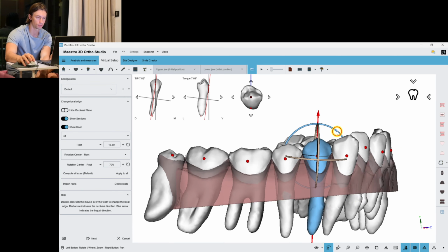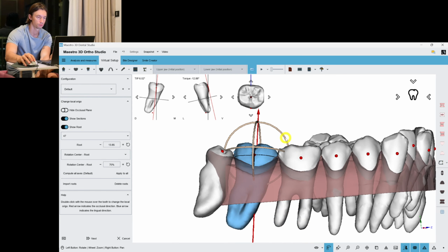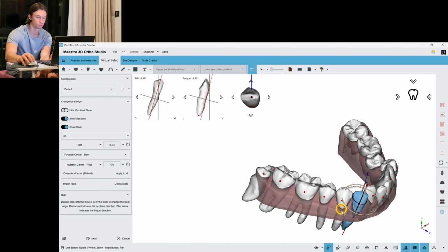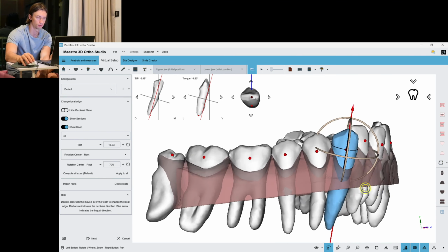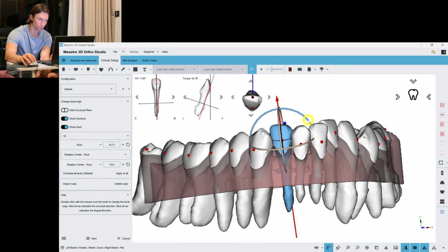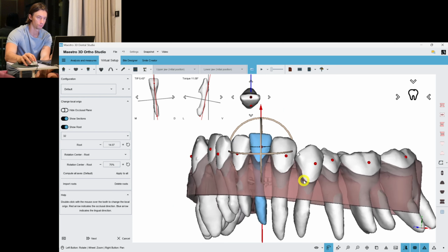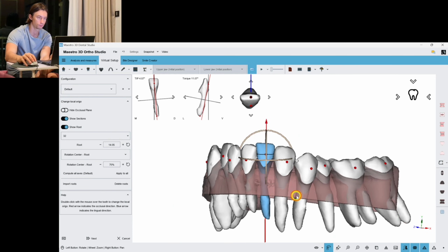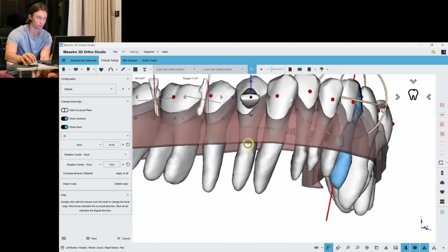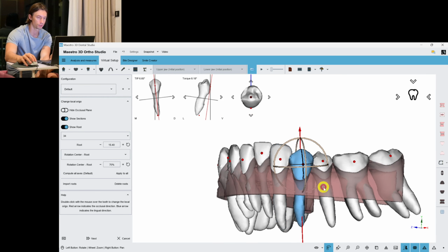So here I'm going to expand, and that's why I place the axis this way, so that the tooth goes straight buccally when I use bodily or tipping buccal movements. Oh, here we have long roots, which is not good for us because the movements will be more difficult for aligners. We also have short crowns, which is also not good. So we'll be slow and accurate here.